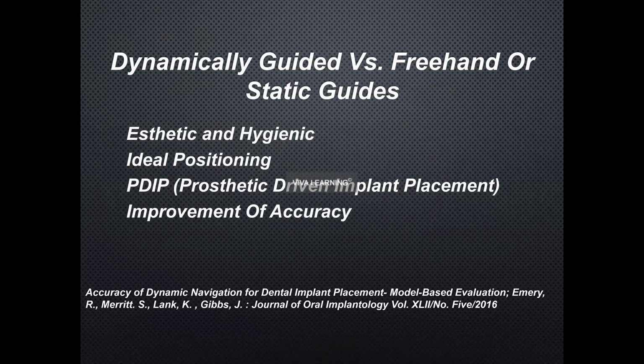So when we're looking at dynamically guided or freehand, what's driving us to this? And here's an article by Dr. Emery and Merritt. But when your patients come in now, you need to have your plan and your final prosthetics be esthetic and hygienic. And they are reading now. You've got a very educated clientele who come to your office and have done their research on implants and guides and implant companies. So you've got to have the ability to converse with them and give them your rationale.